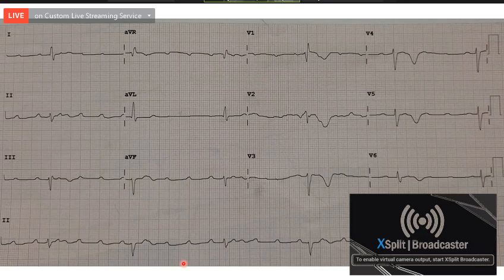How will you explain this? In the limb leads you are seeing a variation. Whenever the chest leads indicate either a right bundle branch block or a left bundle branch block, or show no bundle branch block at all, but the morphology of the QRS complex keeps changing in the limb leads, you should think of the possibility of alternating anterior hemiblock and posterior hemiblock.